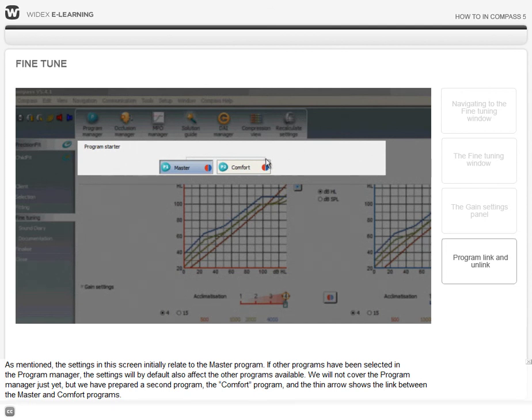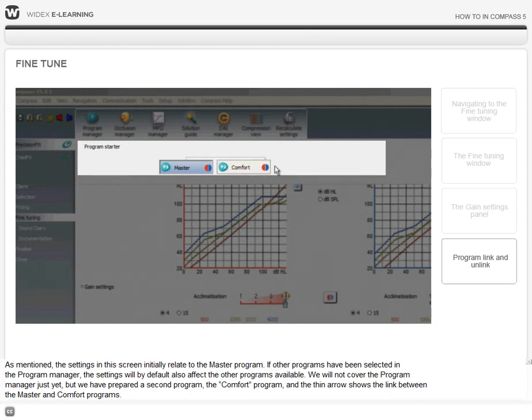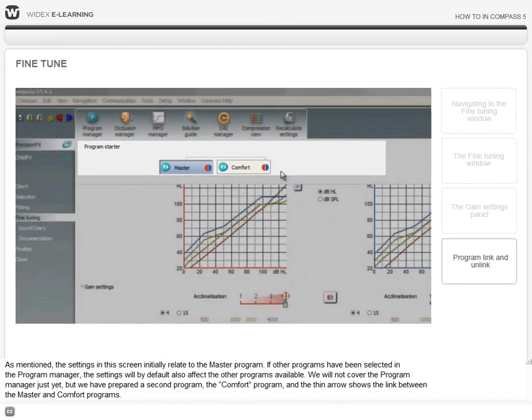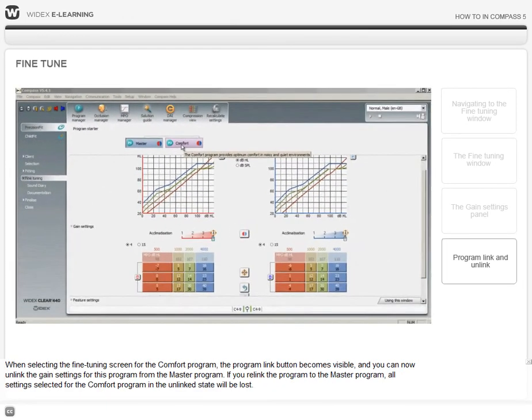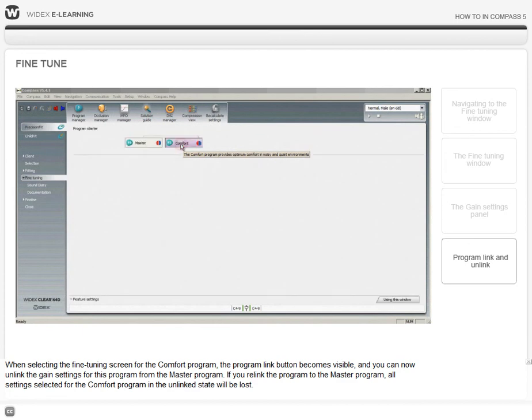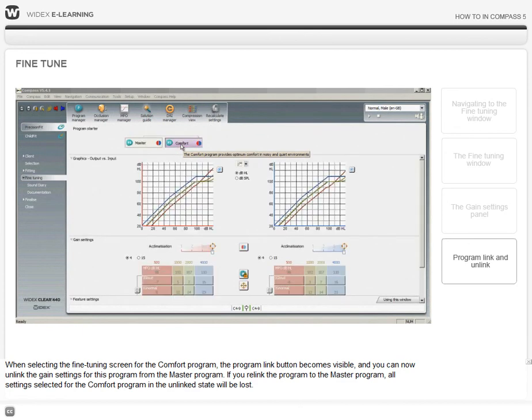We will not cover the program manager just yet, but we have prepared a second program, the comfort program, and the thin arrow shows the link between the master and comfort programs.